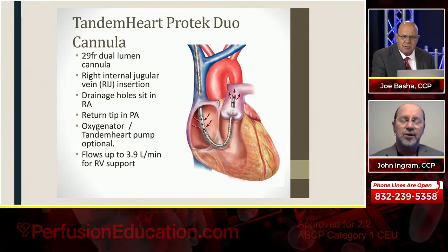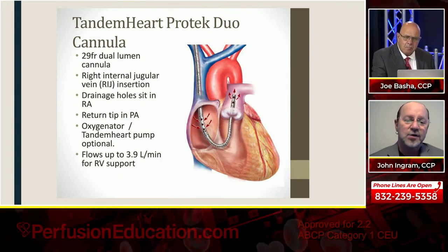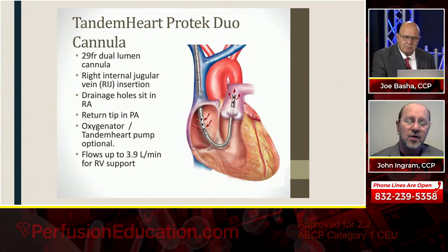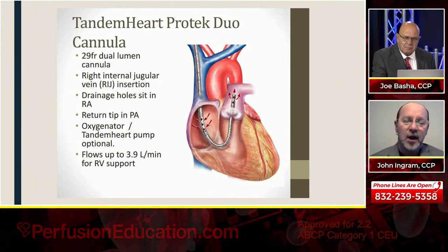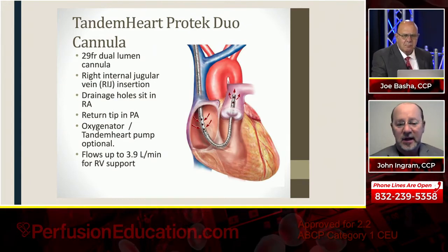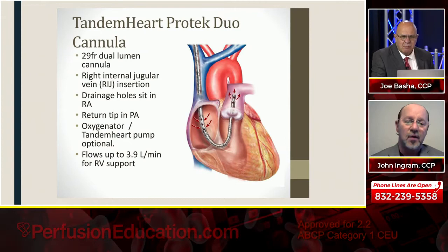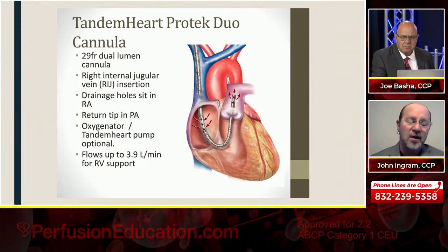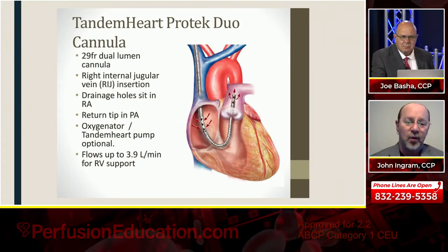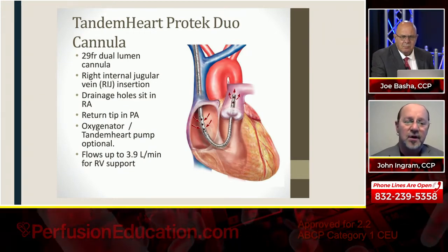In general, as I was pointing out, it's nice that you have one cannula, you stick it in, and you've got total VV support with the Avalon and Crescent, and you can flow decently with those. But it's not like having 2 separate decent sized cannulas. When you see somebody on VV femoral, your pressures and flows compared to what we always see with these single cannulas are much reduced, and you can flow more.